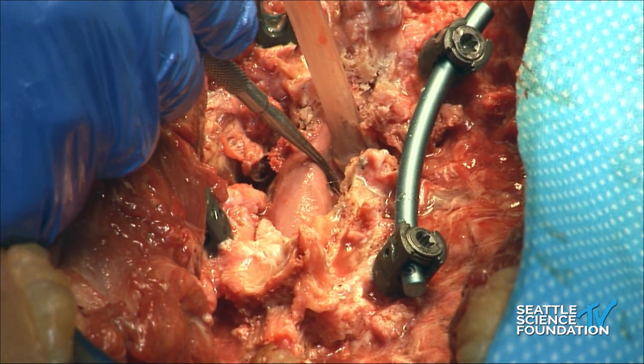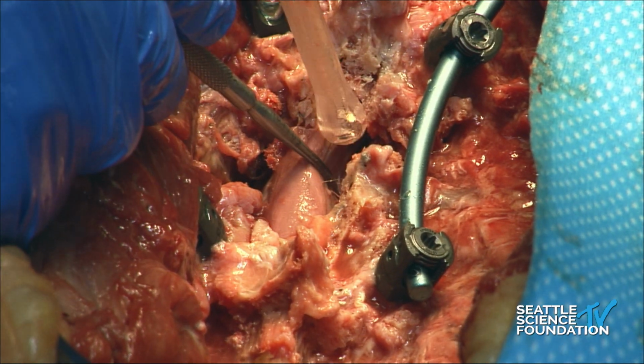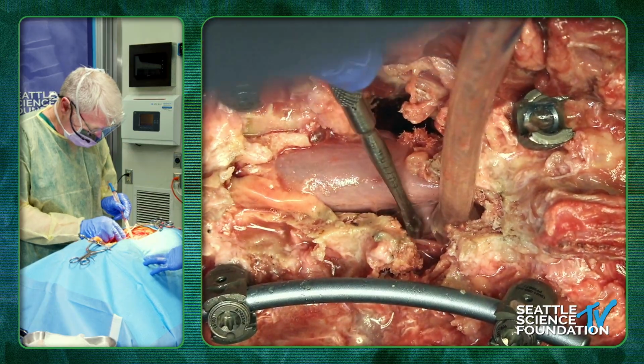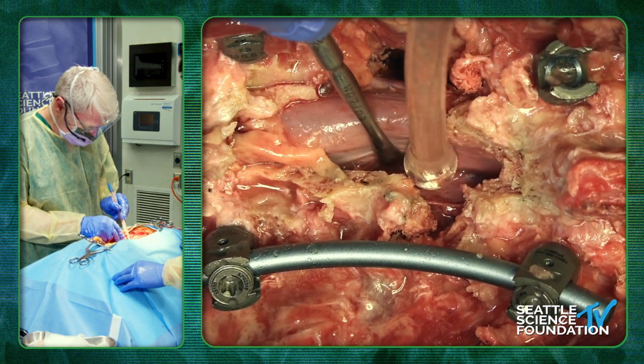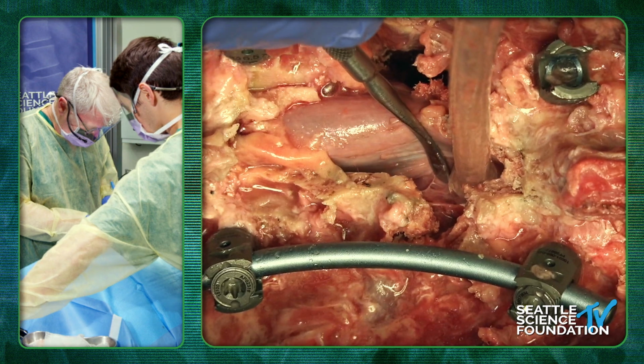So we're going to find the nerve root. We'll find the veins again. You can see the big purple veins there. I don't know if you guys see them. Yes. And so those will get all bipolared. There's a big set of veins here.